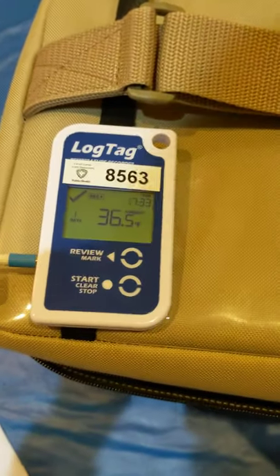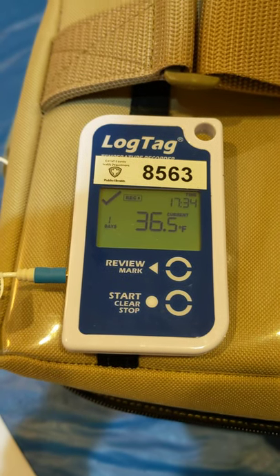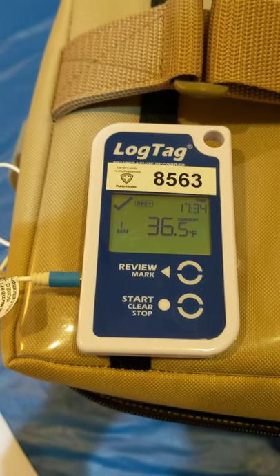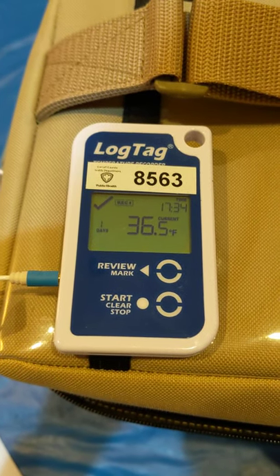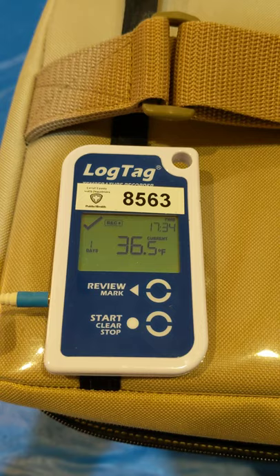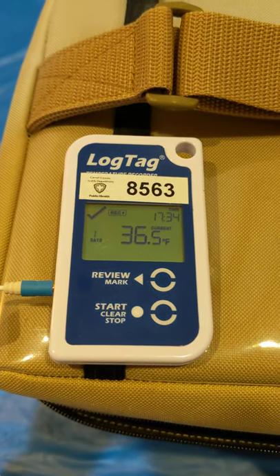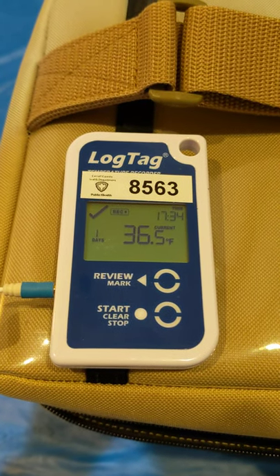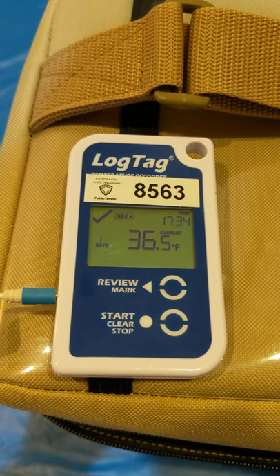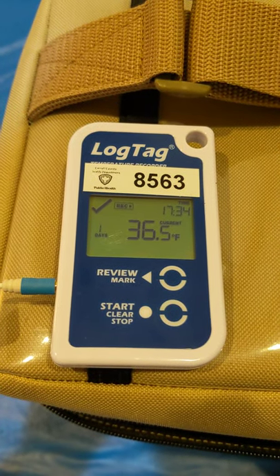The Cool Cube has now been about three hours with the current ice packs and is holding at 34 to 36 degrees. That will be a bit higher when the lid is being opened and closed to remove vaccine, but it will still be within range. I will now do a comparison with an infrared thermometer against the different ice packs against this vaccine temperature of 36.5 degrees Fahrenheit.